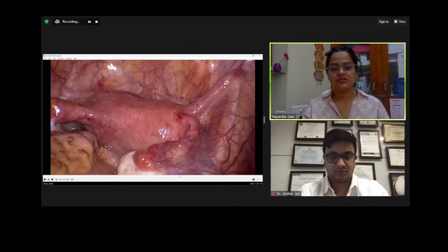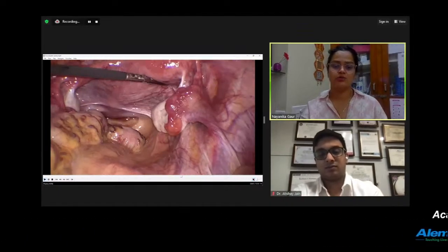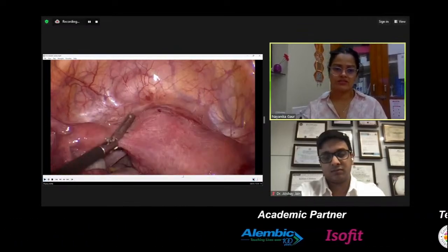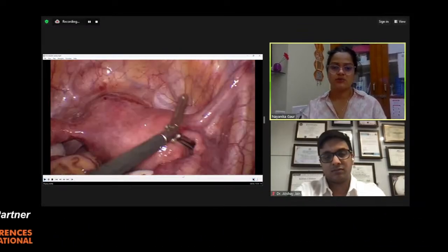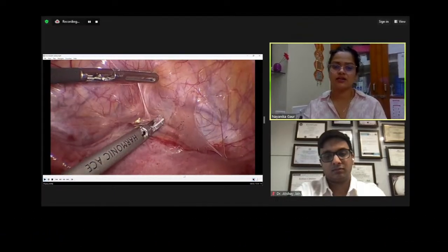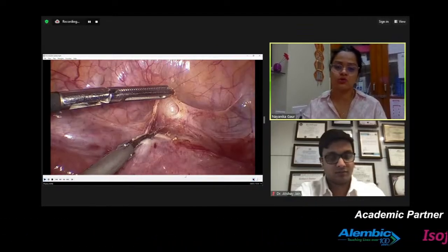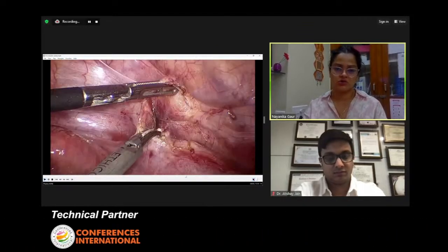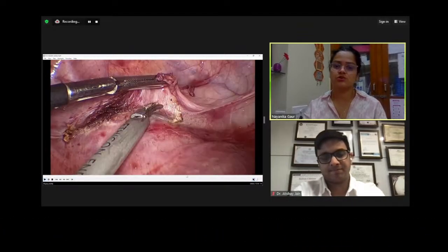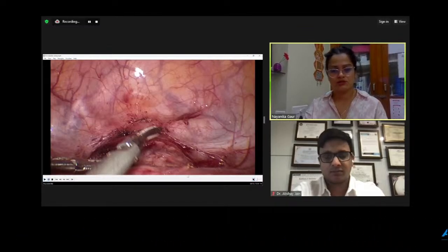Now, this is a case of a scar ectopic pregnancy. This patient has a bicornuate uterus, and the pregnancy was there in the right horn. In the left horn, you can see a small left horn here. This patient was referred to us from somewhere because she had been diagnosed as scar ectopic, and they had tried to suction the scar ectopic tissue. In spite of their suction evacuation, there was some tissue left in this patient. She was bleeding significantly post suction and evacuation.